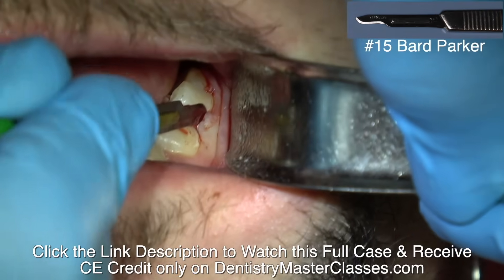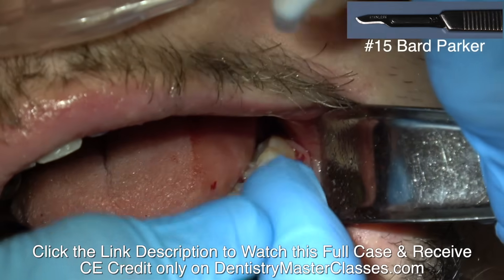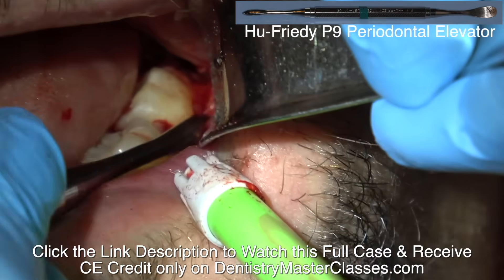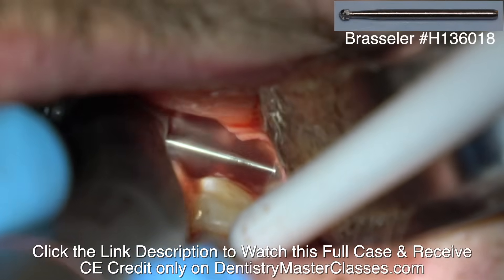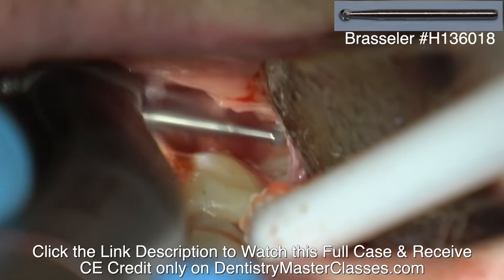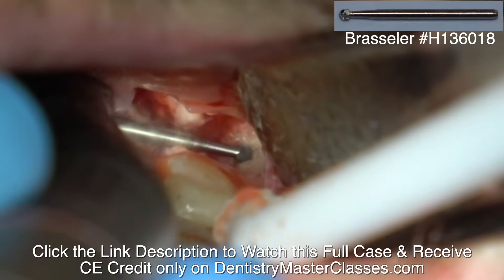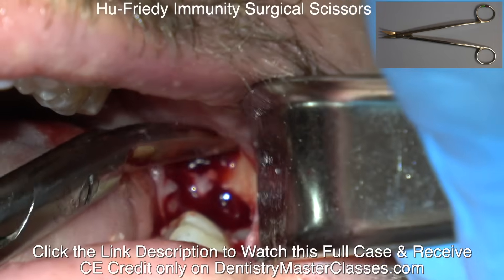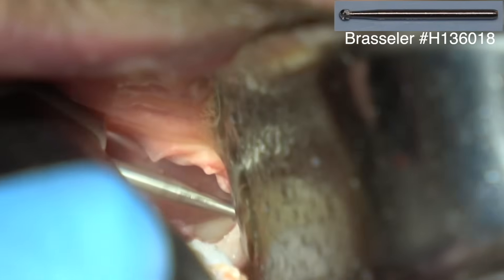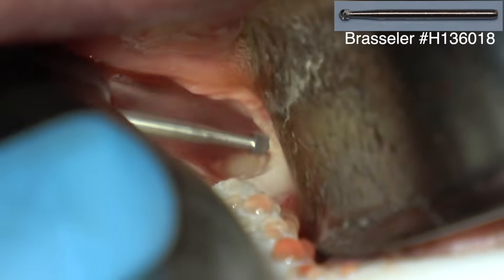I'm reflecting a little further so I can reflect a big flap and have access to the tooth. You want to try not to traumatize the soft tissue with your burr. So I'm reflecting the periosteum again going up the ramus, because you don't get a complete sense of how big the tooth is and exactly where it is until you gain access to the occlusal part. I'm seeing that quite a bit of it — about a third of the tooth — is facial to the second molar.